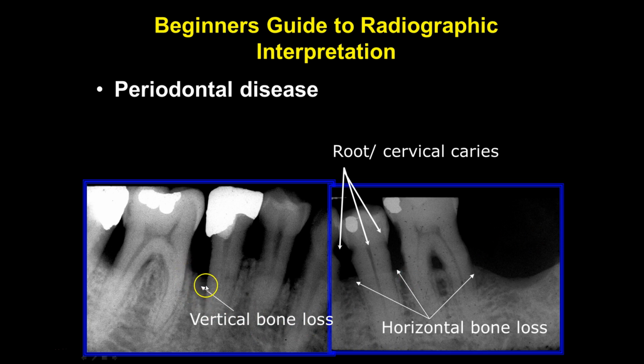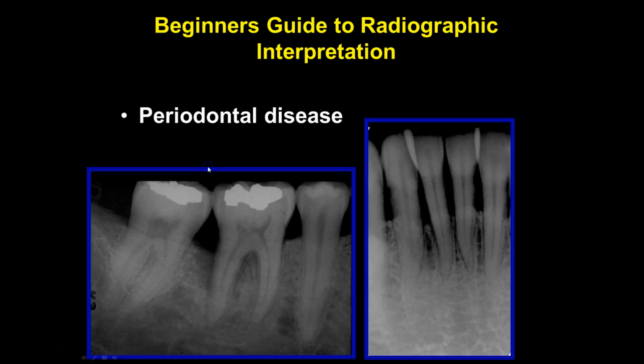Sloping of the bone, remember 2-dimensional versus 3-dimensional. Same thing in this image. First thing that you should be looking for is something's not right. What's not right? Here we have significant bone loss. Oh, we have a mental foramen. Wow, this is the perfect example.